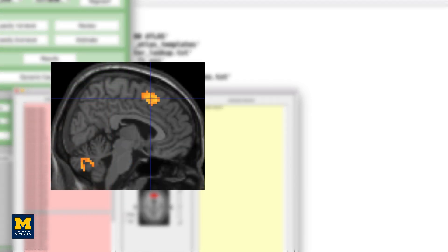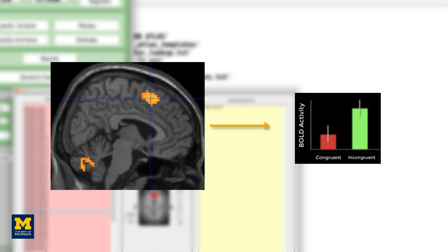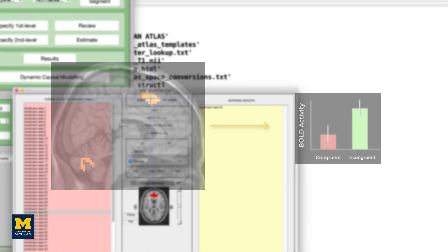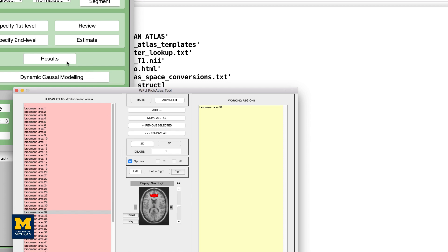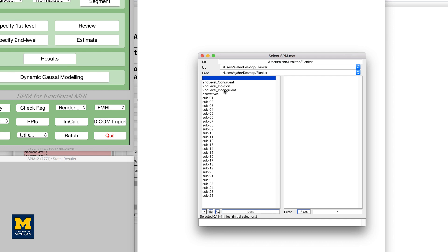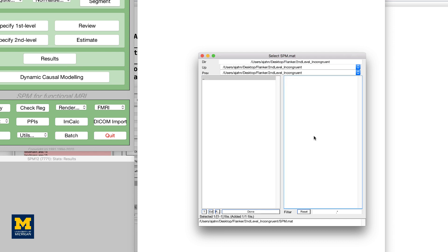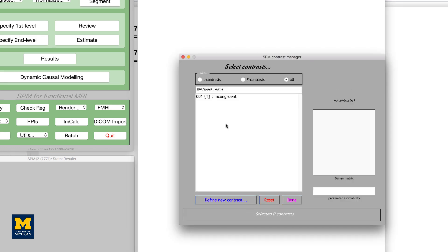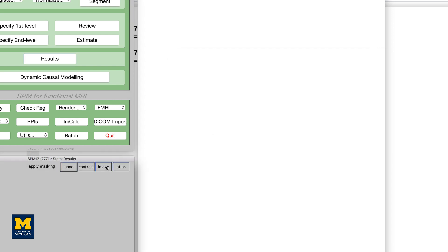Once you've created the mask, you can then extract each subject's contrast estimates from it. In this tutorial, we will extract the individual beta weights for incongruent and congruent separately, and then take the difference between the two. This allows us to determine how the incongruent and congruent beta weights combine to form the contrast estimate. First, click the Results button from the SPM GUI, and load the spm.mat file from the folder 2ndLevelIncongruent. Select the incongruent contrast, and for Apply Masking, select Image.